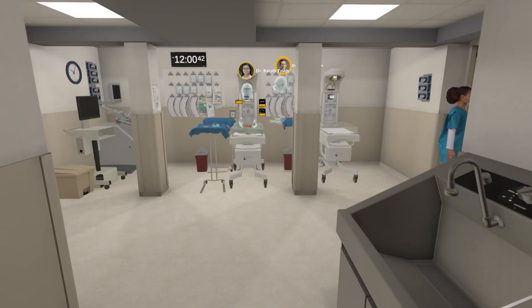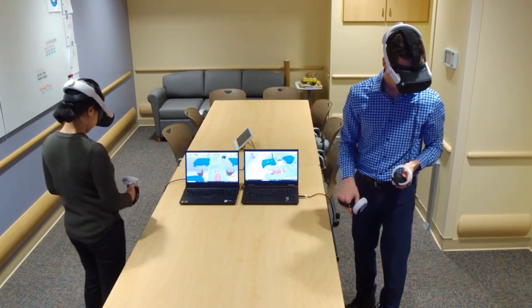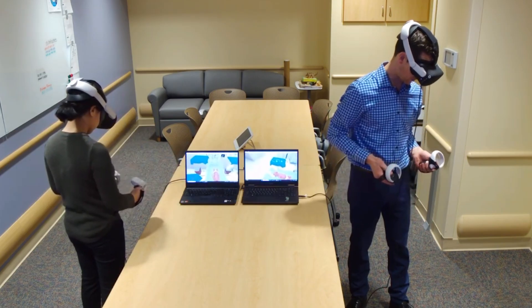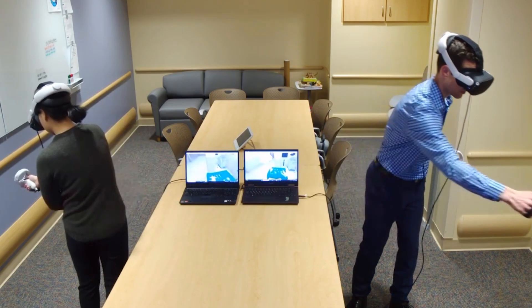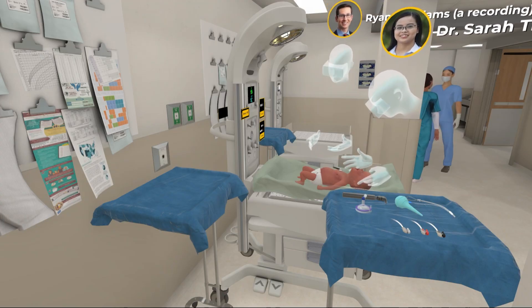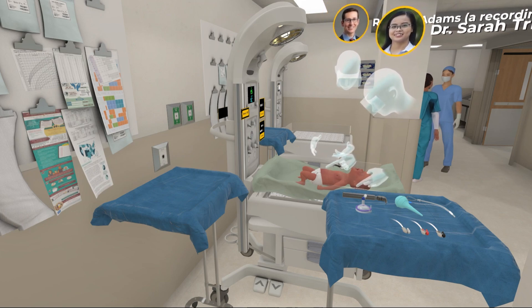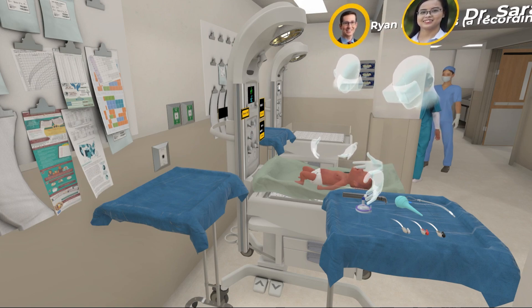I just got paged to this delivery. They called us because this baby's a 30-weeker, just born prematurely, and the baby's having respiratory stress, which is evident by the grunting and the poor color. Let's go ahead and put the pulse ox on. The heart rate is slow — only in the 60s, and our oxygen saturation is in the 50s, so this baby is not doing well.